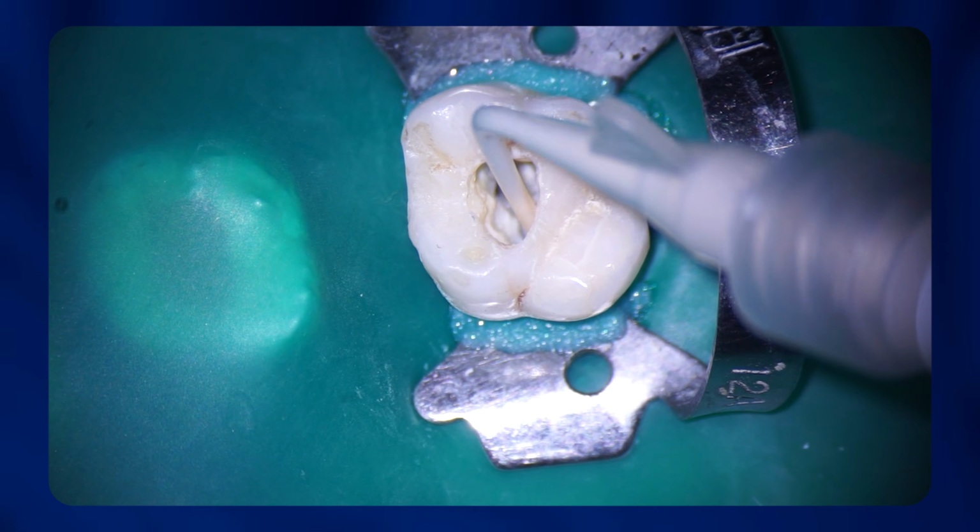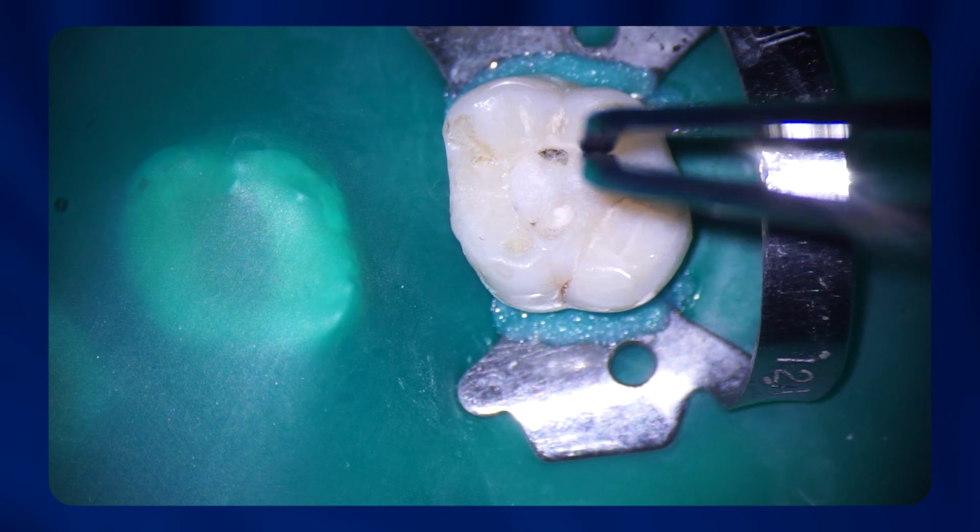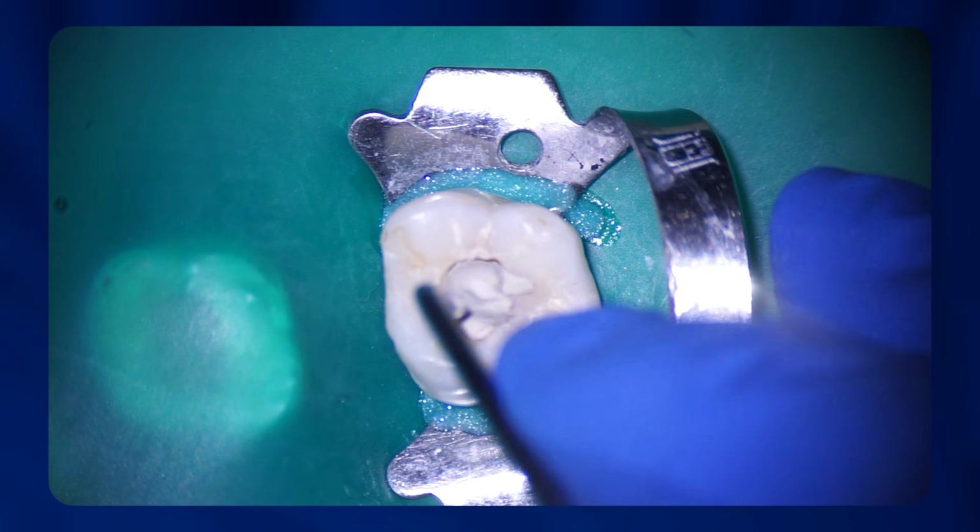So let's take a look at what is done commonly. So here's what most clinicians do. They put calcium hydroxide in the canal, then they take a cotton pellet, put the cotton pellet over the calcium hydroxide, covering the orifices and the pulpal floor. And then they take a temporary restoration like Cavit-G and then place it over the cotton pellet. And then the patient is sent off from the clinic until the next appointment.